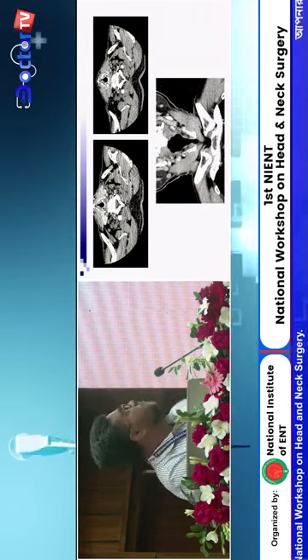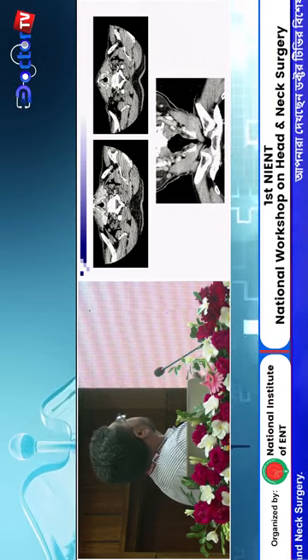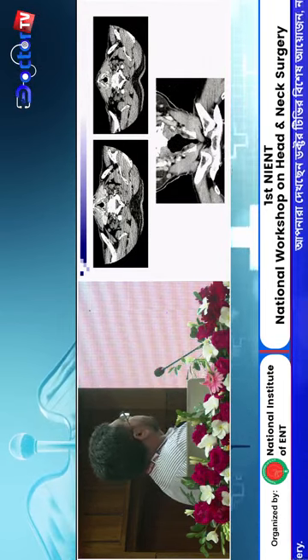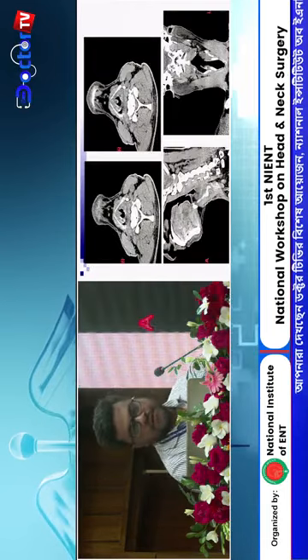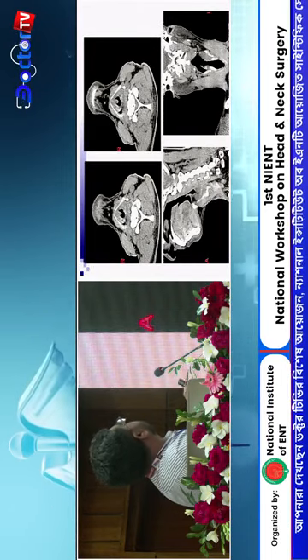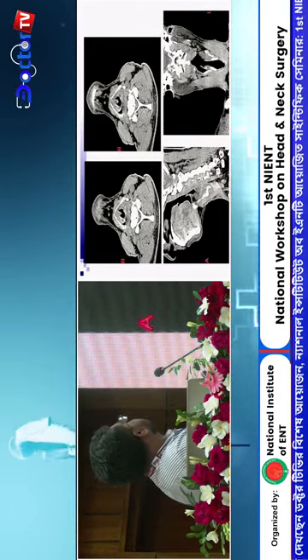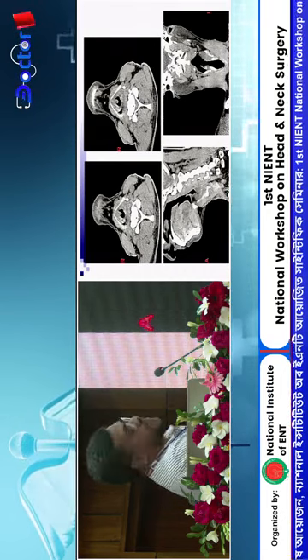Here is a T1 tumor, a small tumor. I saw it previously, a small lesion in the glottic area. It is a T1 tumor. Another tumor involves both sides of the supraglottic area. Okay, this is a T2 tumor.